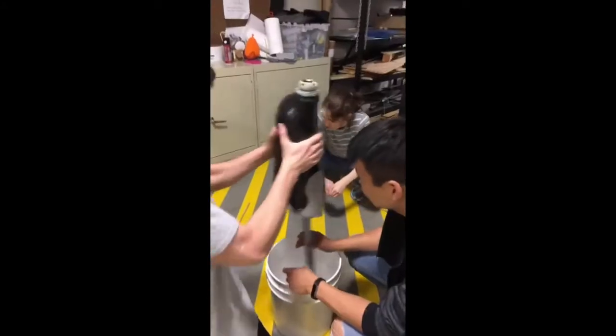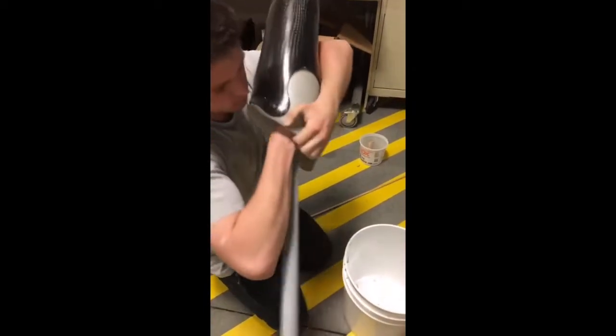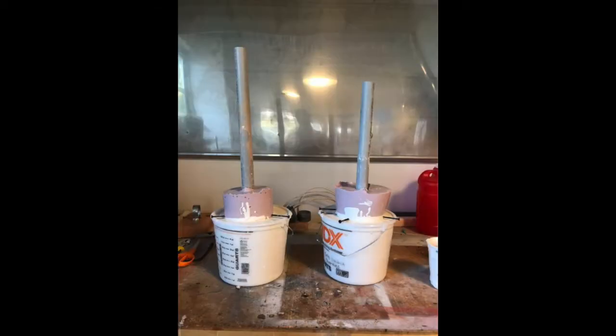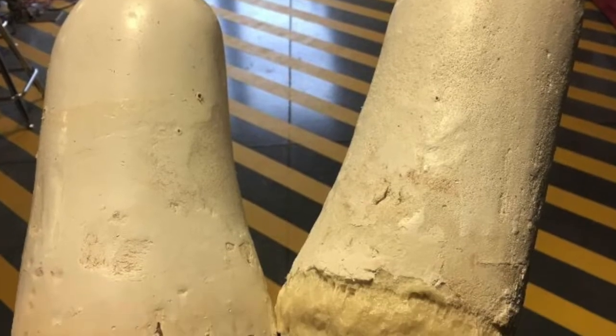We made alginate molds to get the shape before creating permanent foam residual shapes. We lined the negative mold with clay to account for the silicone liner that Jeremy usually wears inside his sockets. Then we poured expanding urethane foam into the mold to create the shape of his residual.